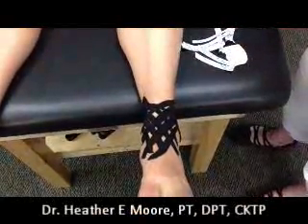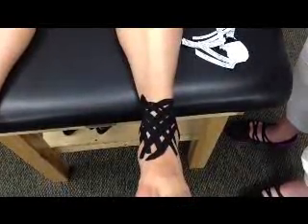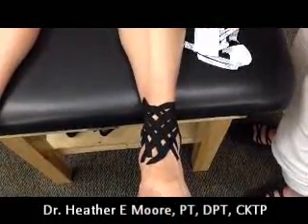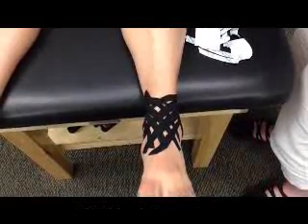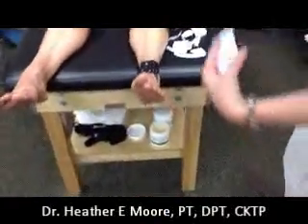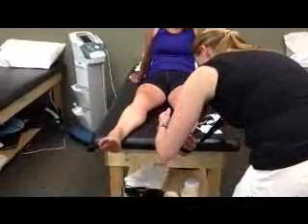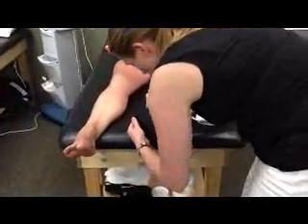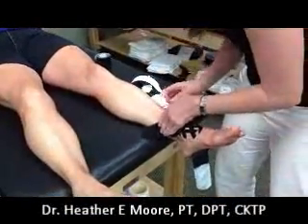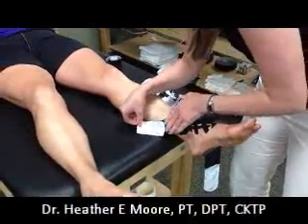That's going to help with the swelling. Now you're going to take the large piece that you cut. You're going to rip it in the middle and tear off that piece of tape. Then you're going to go along the bottom of the foot — this is going to use heavy tension. You're going to go all the way up, start following it around above the malleolus, and then anchor with no tension.